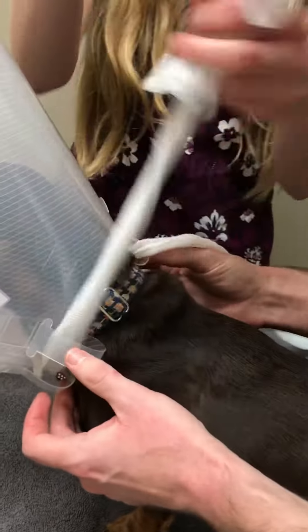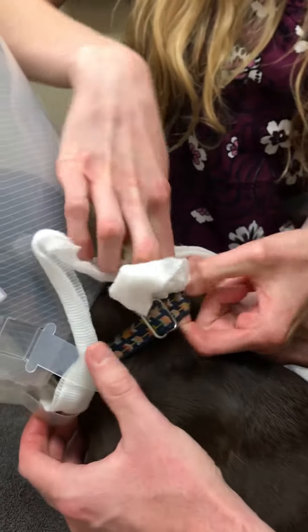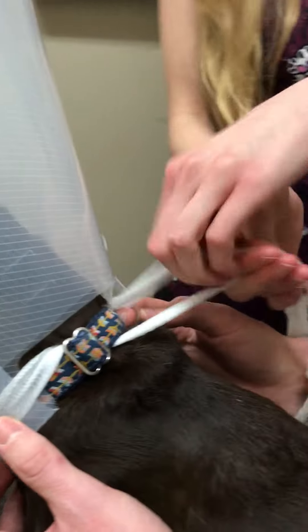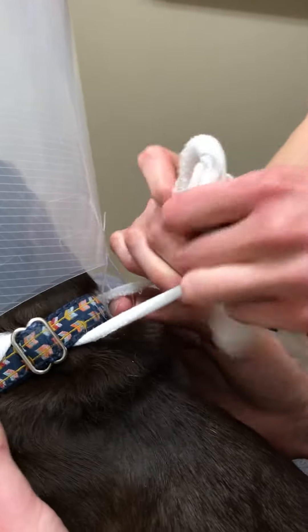It comes with these gauze strings here. A good trick is to loop one piece of the gauze through the collar, just to help anchor it on. Then we're going to tie this in a little bow here.